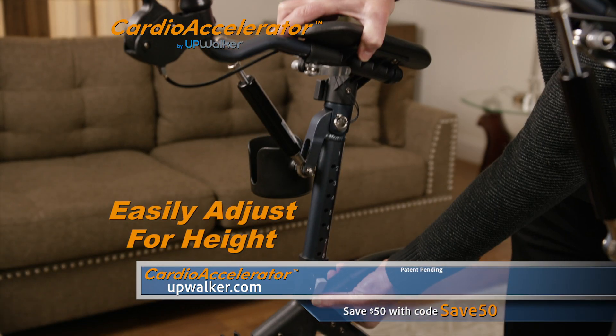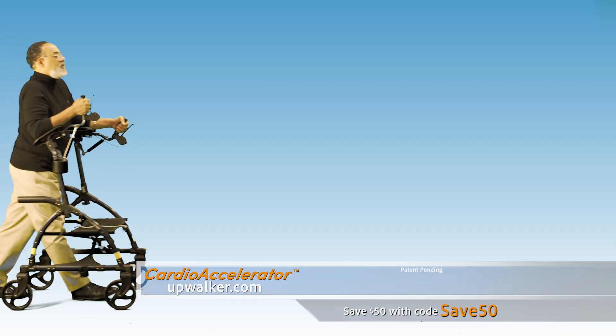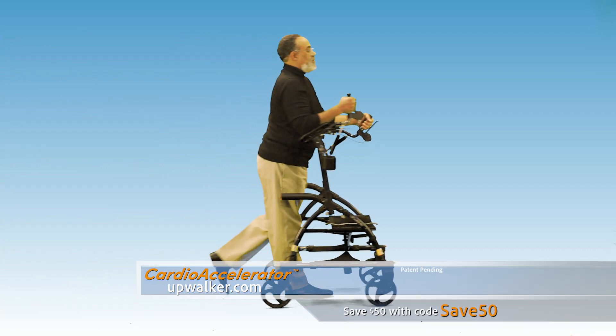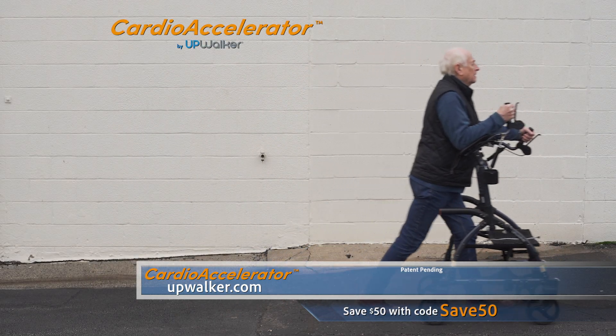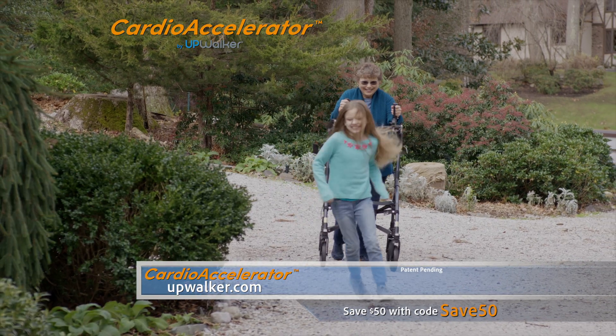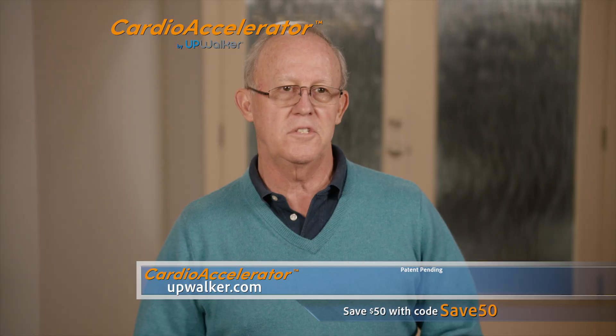The clever design makes it easy to adjust for a user's height. Cardio Accelerator users walk further, pull their head up higher, and get an effective workout while doing so. Just look at the difference it makes in a user's posture and mobility. And exercise is crucial in maintaining healthy muscle function, including the most important muscle, the heart. It's such a great workout.